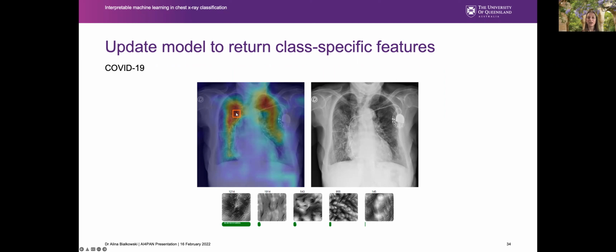You just train a neural network and see what it gets. And in fact, people have got really good results in terms of accuracy just doing that. But I think we need to look beyond just looking blindly at the image, and more and more people are looking into that. So focusing on segmenting the lungs first and then only looking at those parts is definitely something that a lot of people are doing. It won't have as many of the interesting problems and flaws that we see here. Okay, great. Thanks.